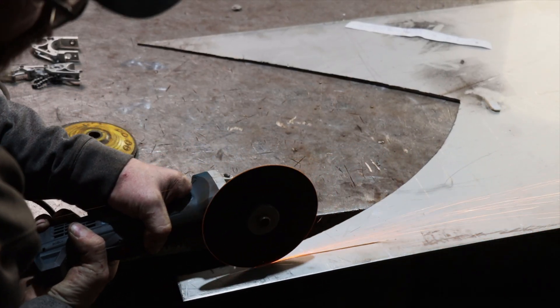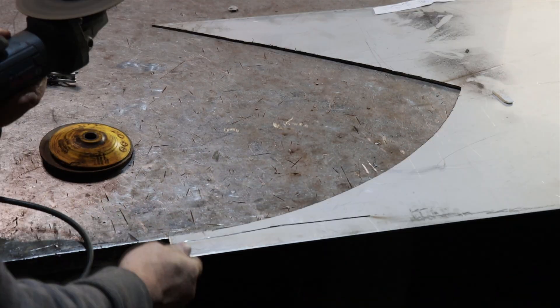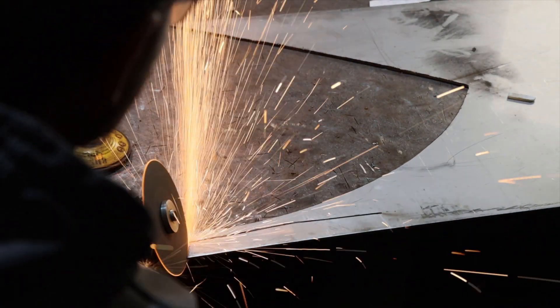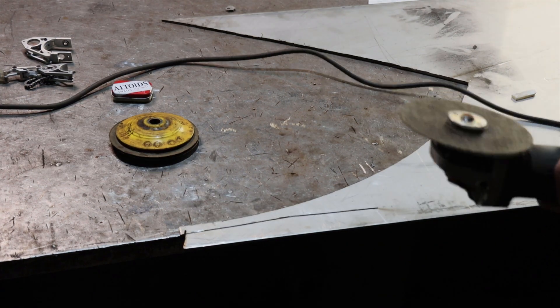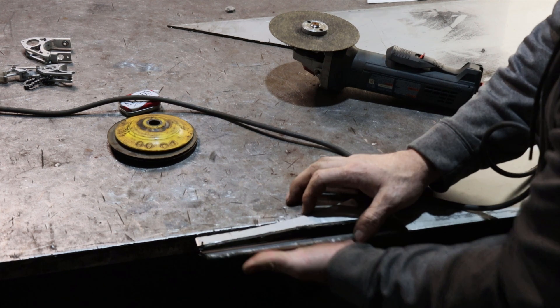Nobody really wants to listen to me cut out this blank with a grinder — it's really loud and abrasive. Basically what's going on here is I'm cutting out the rough profile of the stainless blank that's going to become the socket for my new prosthetic hand. I developed this profile by drawing a bunch of reference marks on my residual limb and made the paper template from that.